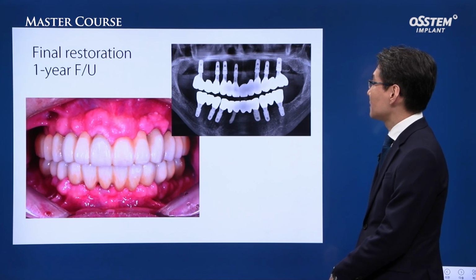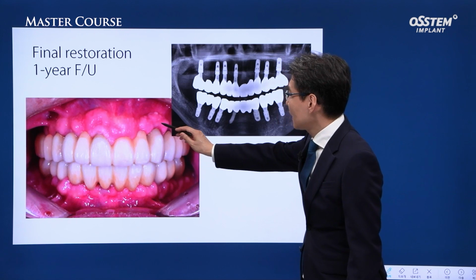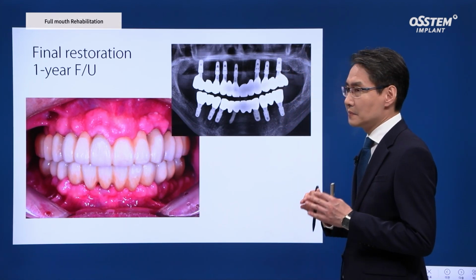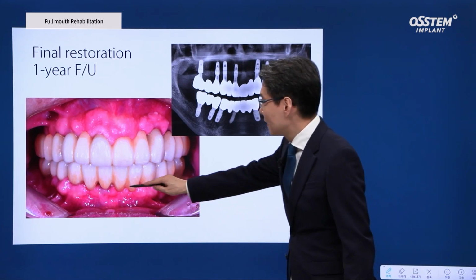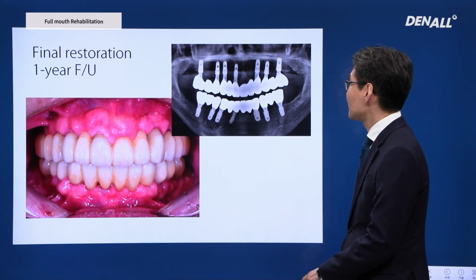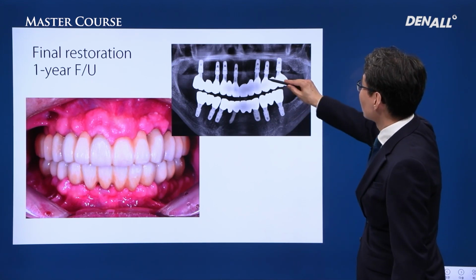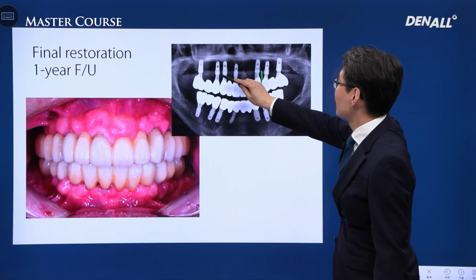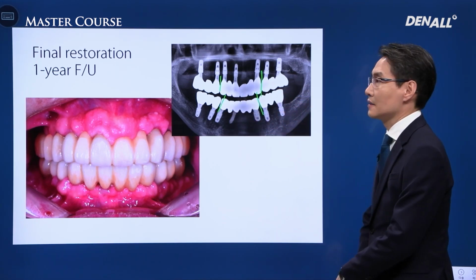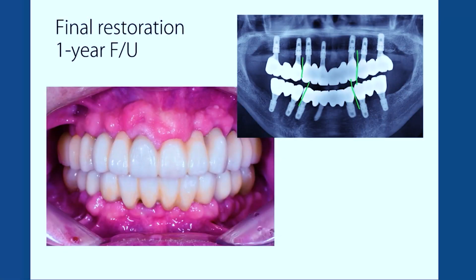This is at 1 year follow-up. If you look at this patient, what stands out is that the patient has a bit of hyperplastic gingiva. There is little gingival resorption, and with just a small amount of calculus, there can be swelling, almost to the point it looks hyperplastic, but there was no severe inflammation, but marginal bone level was nicely maintained, and a prosthesis was segmented between canine and first premolar. A total of 24 units of teeth were delivered in the prosthesis.